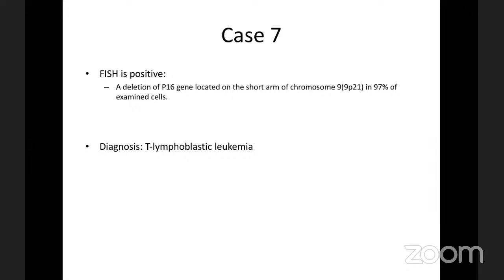If you remember that in the case of the B-lymphoblastic leukemia, we saw the hand mirror, we saw the very aggressive morphology of the cells, you may assume that case may be a T cell. This one, you would think, okay, this case could be B cells, very fine blast, small, you wouldn't expect that this is a T. But nowadays patients are not textbooks anymore. So whatever you are used to describe your blast, there is always an exception.